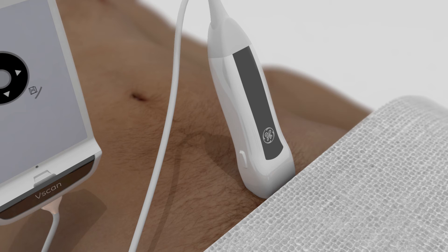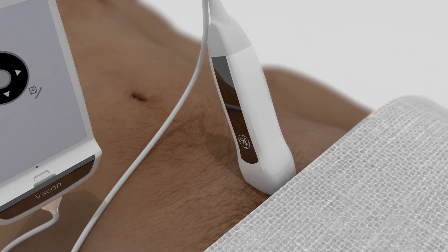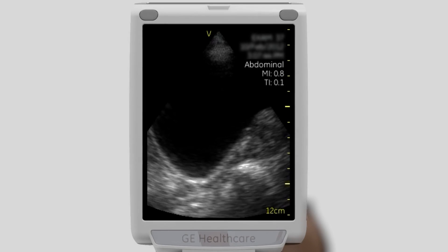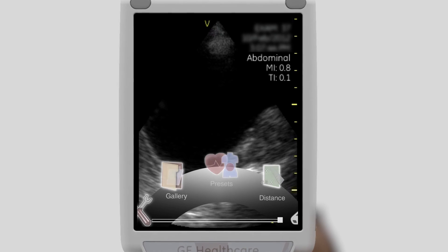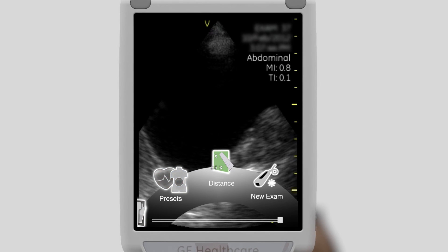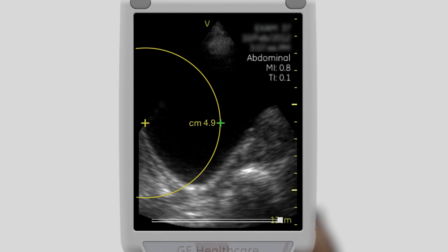To obtain a longitudinal view of the bladder, position the probe so that the probe marker is pointing toward the patient's head. In the longitudinal view, scan the bladder from the left to the right. Obtain a mid-longitudinal image where the height and antero-posterior dimensions of the bladder appear to be at a maximum. Measure and document the longitudinal and antero-posterior dimensions.